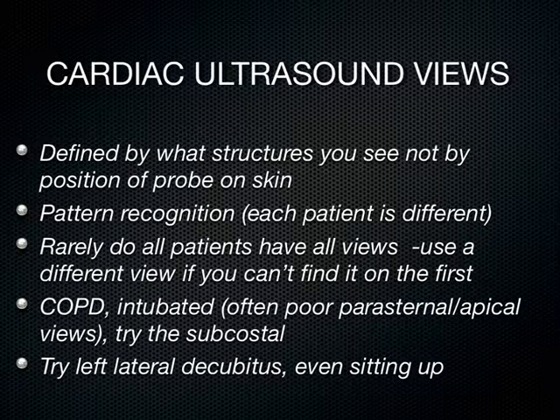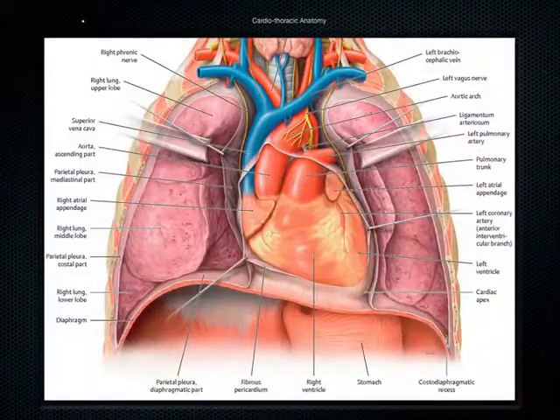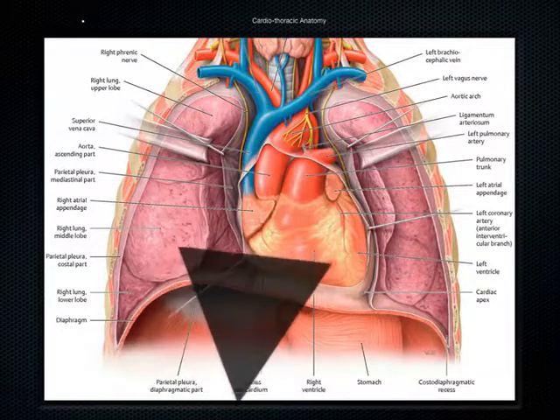And you watch a cardiac sonographer do an ultrasound. They always roll the patient. They stick a pillow under the right scapula and roll the patient left lateral decubitus, which brings the PMI to the chest wall. You can always get better views if you roll the patient to their left. That's the big secret here. Not unlike looking for the gallbladder, the liver is the window to see the heart. We use that liver as our window in order to see the heart.